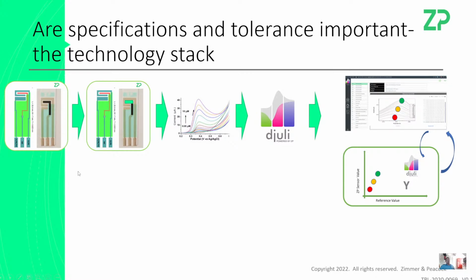When you just look at a glucose sensor in isolation, and think the only thing I'm going to get this person to control is the screen printing, you're missing the fact that every part of this stack of technologies can be improved. So it's not good to consider these things in isolation. Screen printing, deposition, excitation of the sensor, interpretation of data: these have all got to be thought of together.